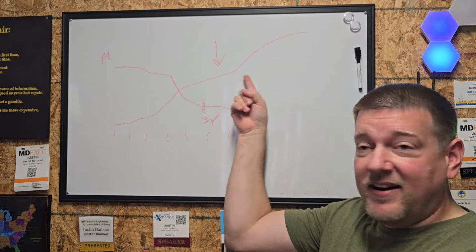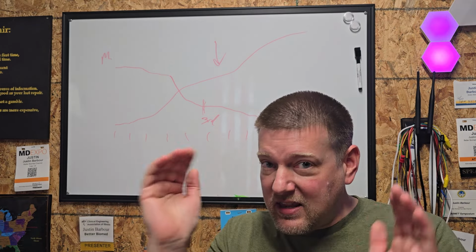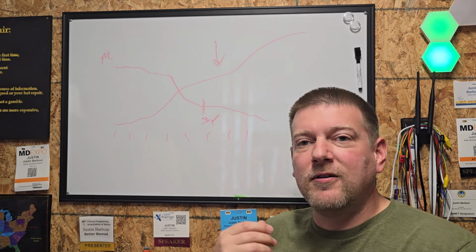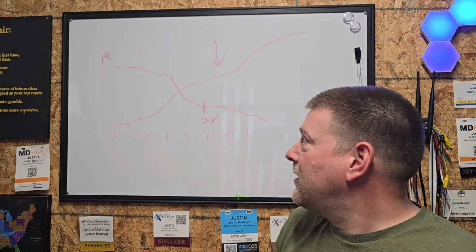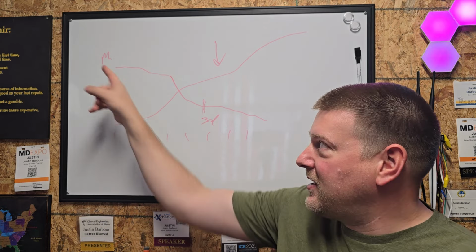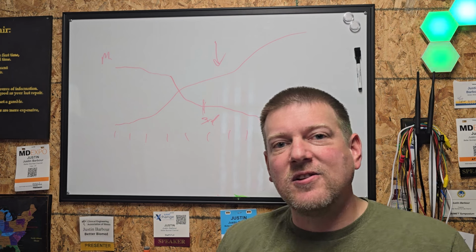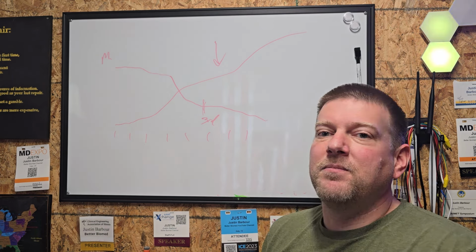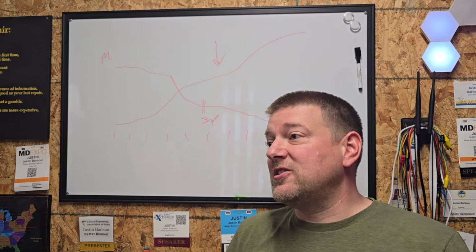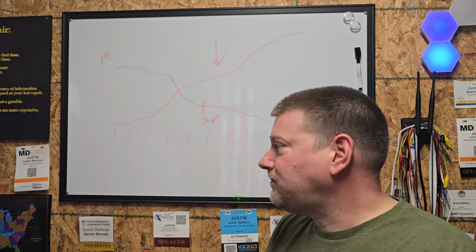Because the cost of repair is way up here. So there's the sweet spot. 3 to about 8 years is when items are extremely repairable. You can find people that have knowledge of them. But outside that bracket, in the beginning, it's impossible to get stuff repaired except by the OEM. In the end, third parties have all sorts of items in stock, not an issue, but the market value might be so low, it's not repairable. It's just easier to buy a used piece of equipment of the same model.